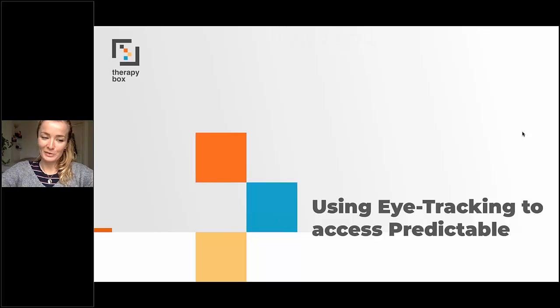I work for TherapyBox as Predictable Project Manager, and today I will speak about a new exciting feature that we just integrated to Predictable, which is eye tracking.